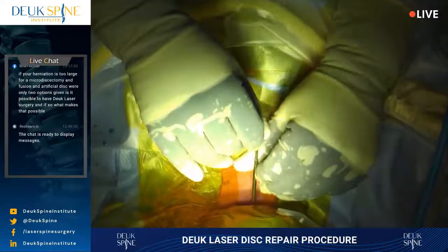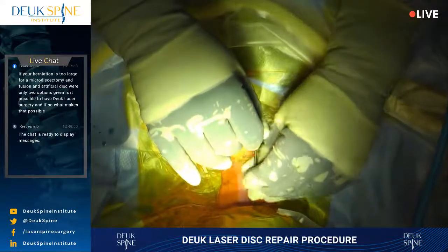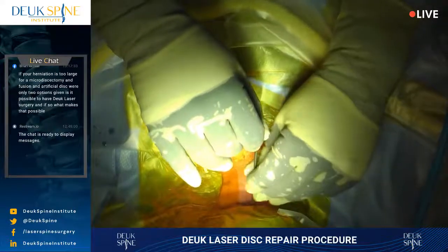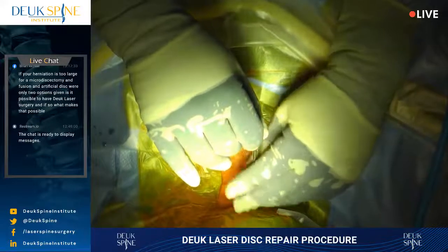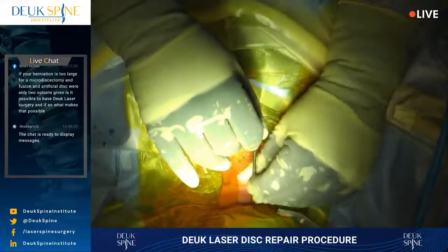And that's been the problem with traditional spine surgery in the neck, is that surgeons have always taken the whole disc out just to get to the little piece in the back where the problem is. And that's why endoscopic surgery is so much better.